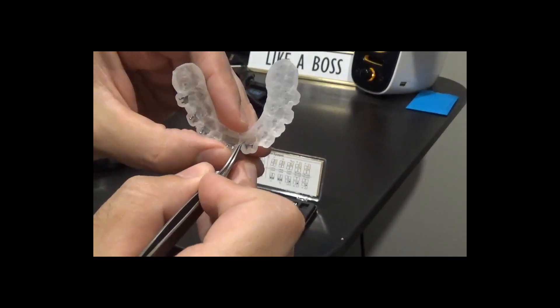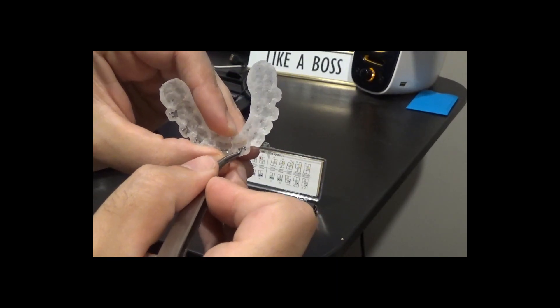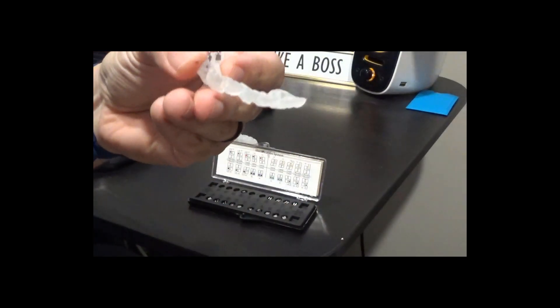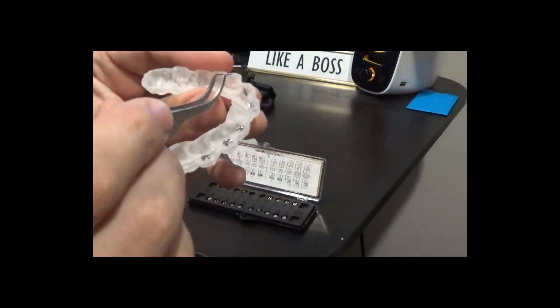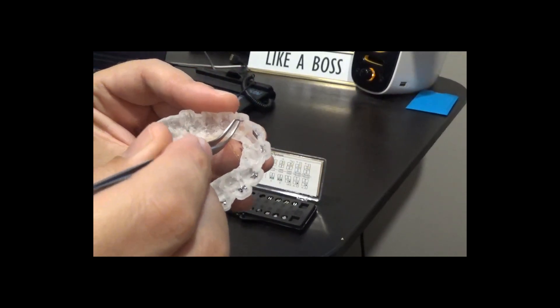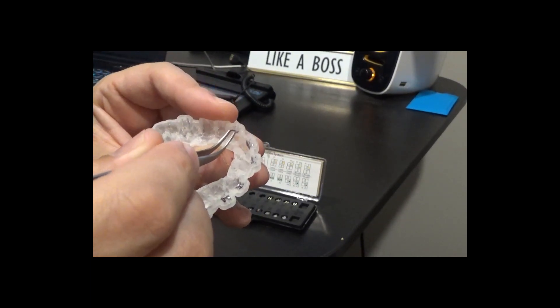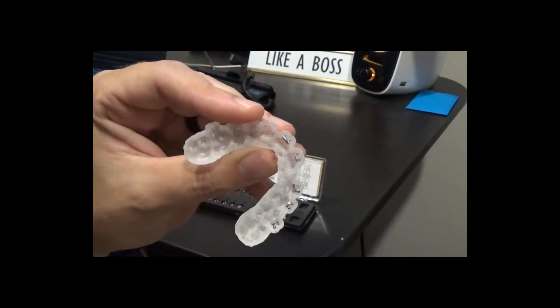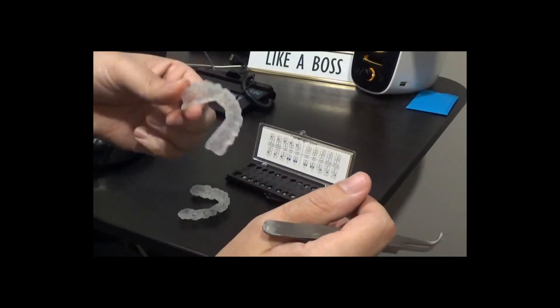We put it in here and you just push it nice and flush to the incisal. Make sure it's fully seated and that's it. In the slots, you're going to have these two vertical lines here, these indentations, for those tie wings to sit into. You want to seat it nice and tight in there and then as far incisally as possible, and that's what's going to seat it in there.